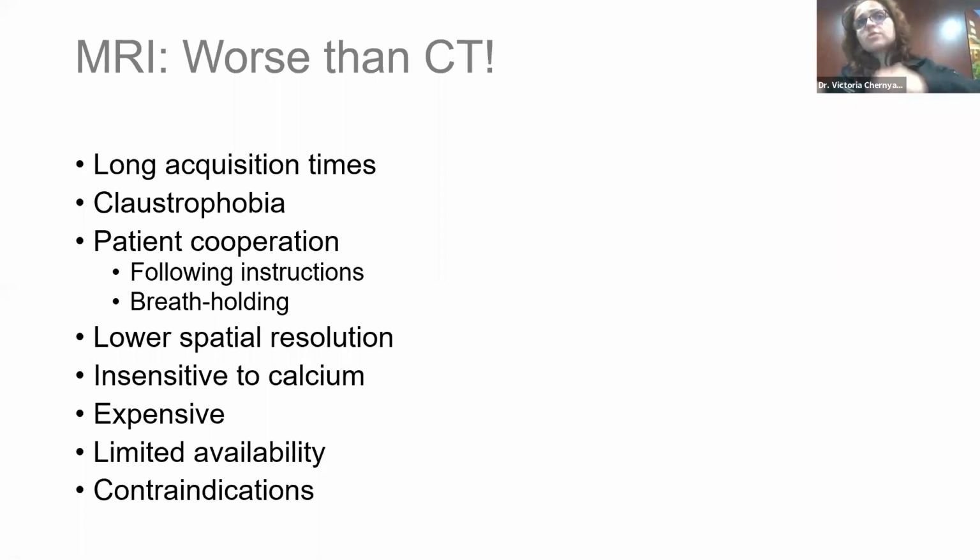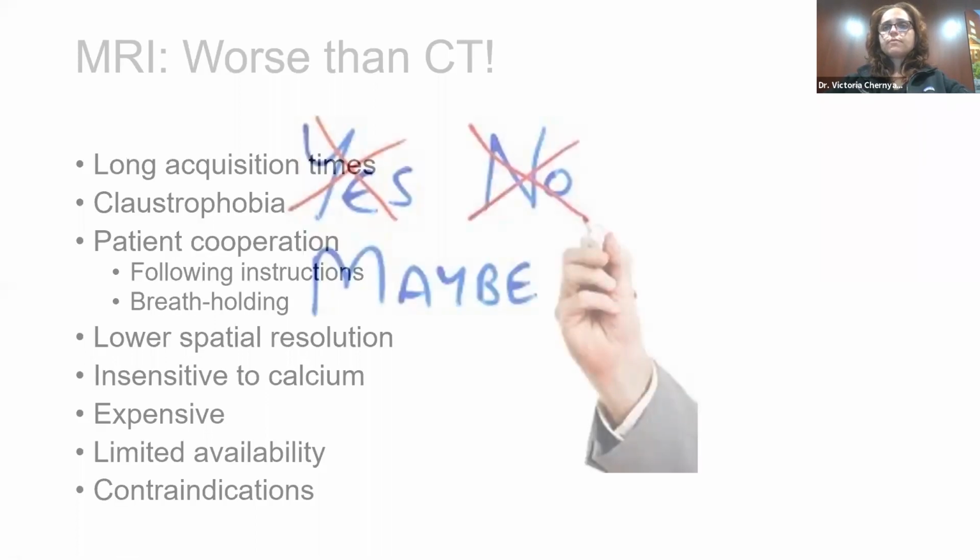And there's a list of contraindications to MRI, which we'll talk about in a second, but patients with certain aneurysm clips and certain pacemakers just cannot get into MRI because of safety concerns.